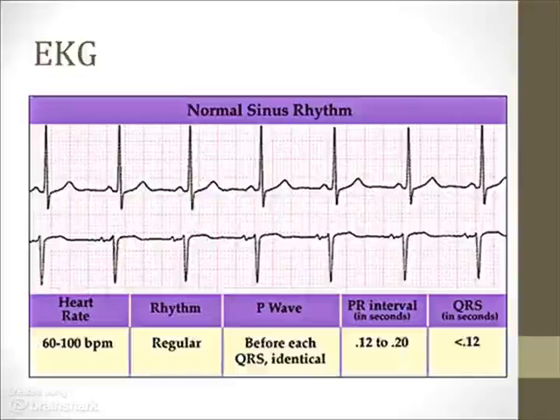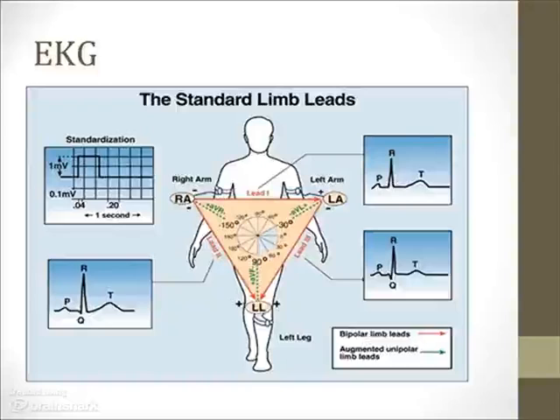Again, the ECG, a non-invasive study which measures the electrical currents or impulses that the heart generates through a cardiac cycle, is demonstrated here on this slide, which we have seen in our conduction podcast, and this is, of course, normal sinus rhythm. This slide demonstrates the standard limb leads, the right arm and left leg, which is a representation of a 3-lead EKG.